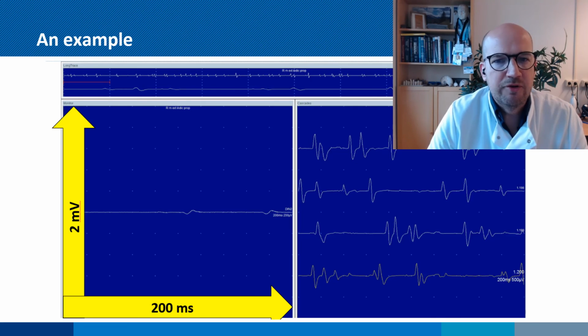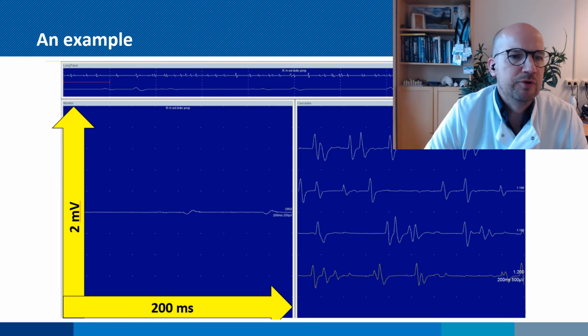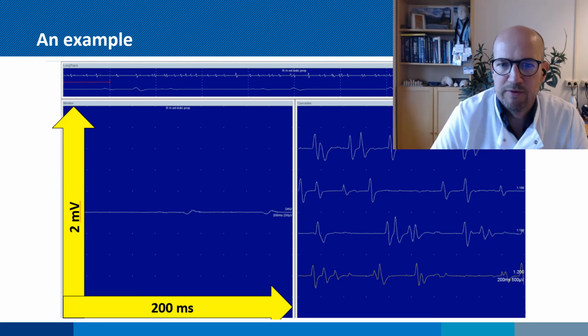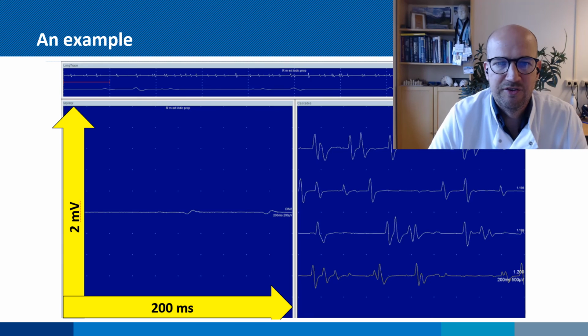Now, if you look at this video, try to see if you can judge the recruitment pattern as well. Can you tell whether this EMG is normal, neuropathic, or myopathic? Let me know what you think in the comments, and I'll soon be back with more real examples and explanations.